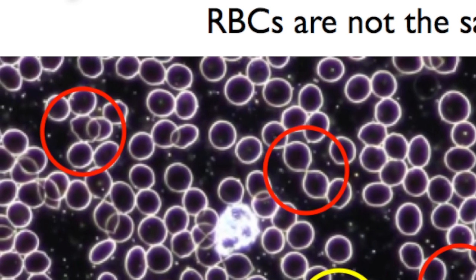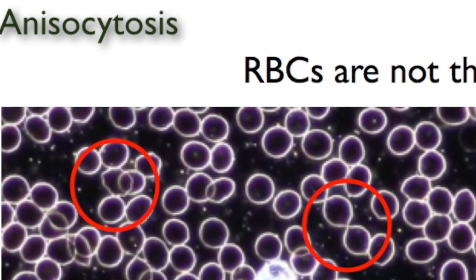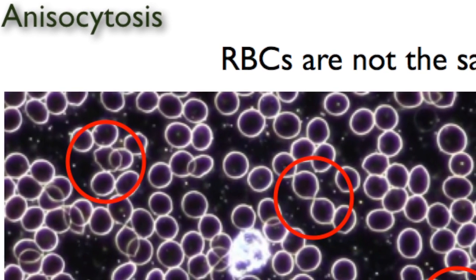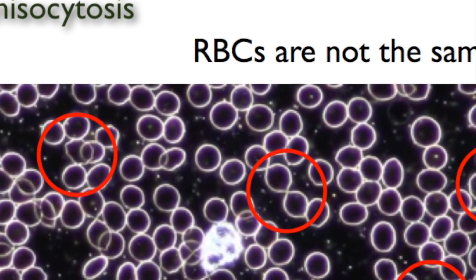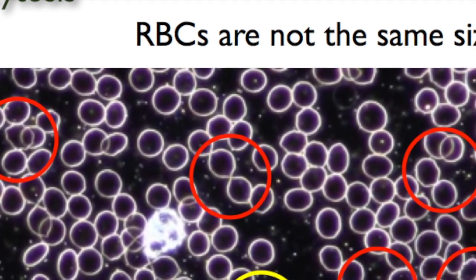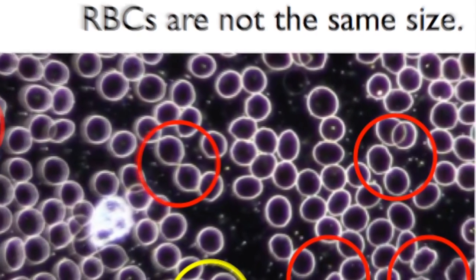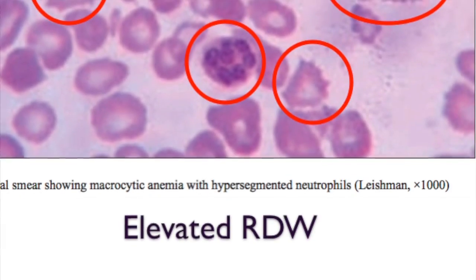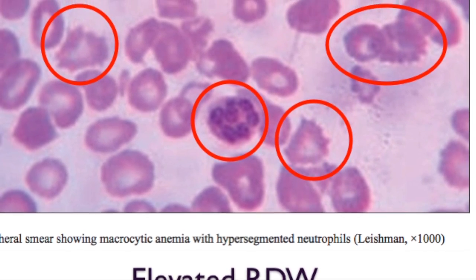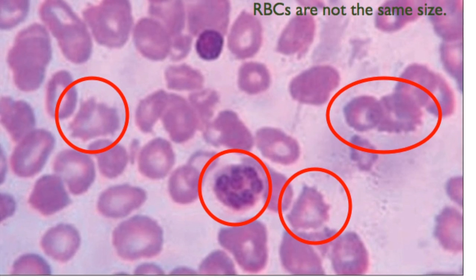In dimorphic anemia, the patient may have multiple red blood cell populations. The dimorphic blood picture will look like a population of small, normal, and large cells of different sizes and forms. The blood picture shows the presence of morphologically different red blood cells. The cause of the dimorphic anemia has to be established in order to systematically manage the patient. Combined deficiencies of iron, due to anemia of chronic inflammation or chronic disease, and folic acid more commonly lead to dimorphic anemia with clinical features of both forms of anemia.